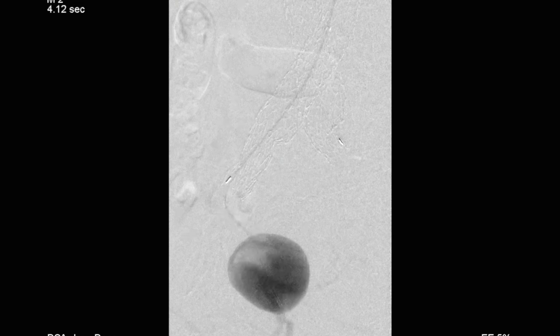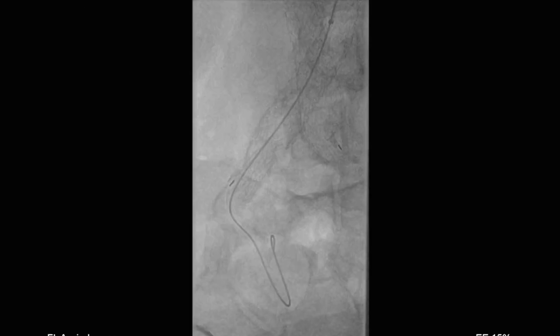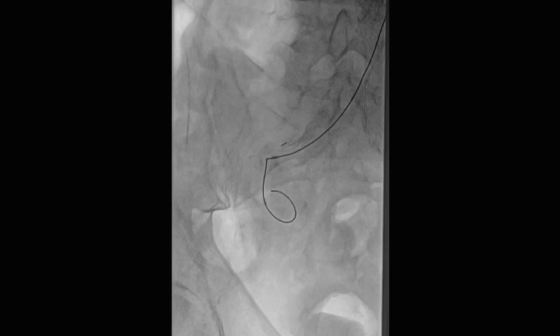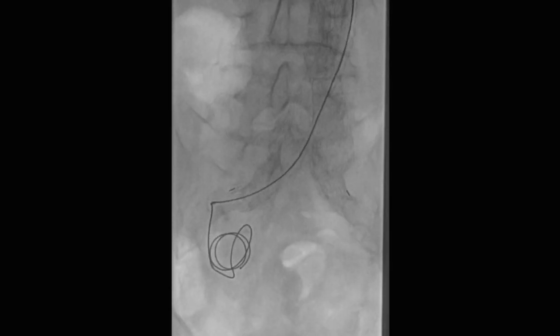A catheter has now been placed inside the aneurysm — you can see it's a beautiful little aneurysm, unusual in that it's not flush with the origin and is fairly distal, which is ideal for embolization. The plan was to use coils to embolize the aneurysm. You can see that wire is embedded in there pretty well, and we now have our diagnostic catheter seated way down inside the aneurysm and can start to deploy the coils.